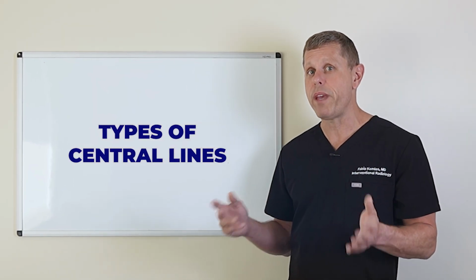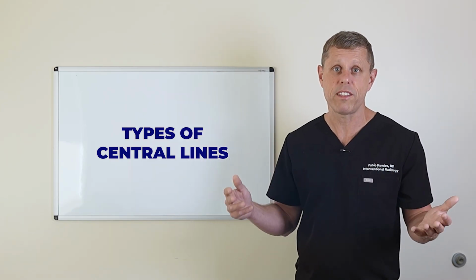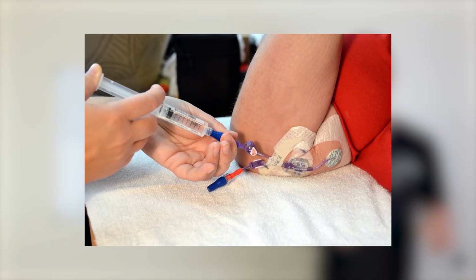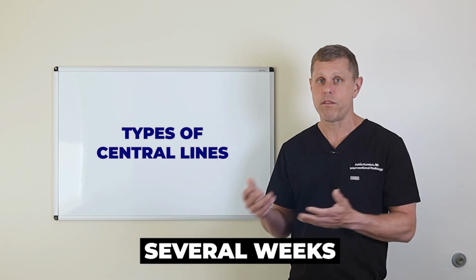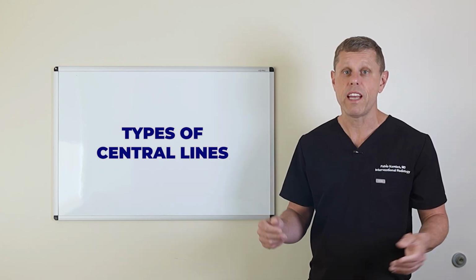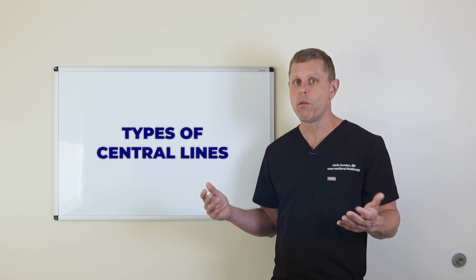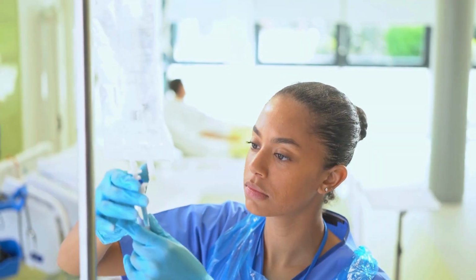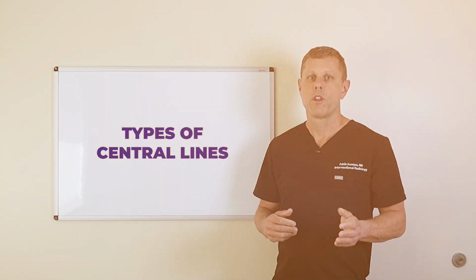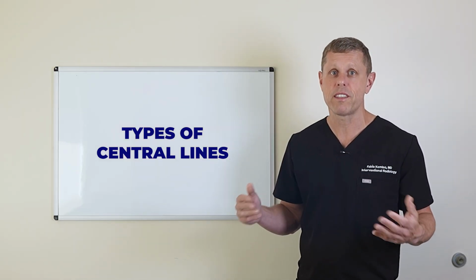The other good thing of PICC lines is that they can be placed at the bedside. They have very little risk of placing them. And also they can be used at home, so patients can go home with a PICC line and use them for antibiotics if they need for several weeks, or even for TPN. And some patients I've seen can keep a PICC line for up to a year or two if they're undergoing total parenteral nutrition, if unfortunately they require nutrition by IV because they cannot eat. So those are the non-tunneled central lines and the PICC lines, which are the simplest types of central lines.